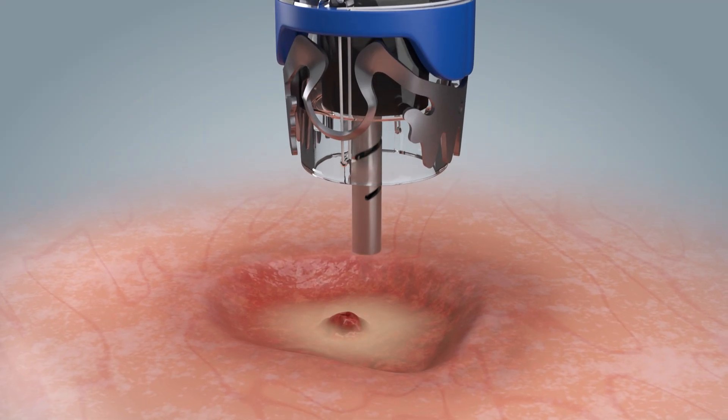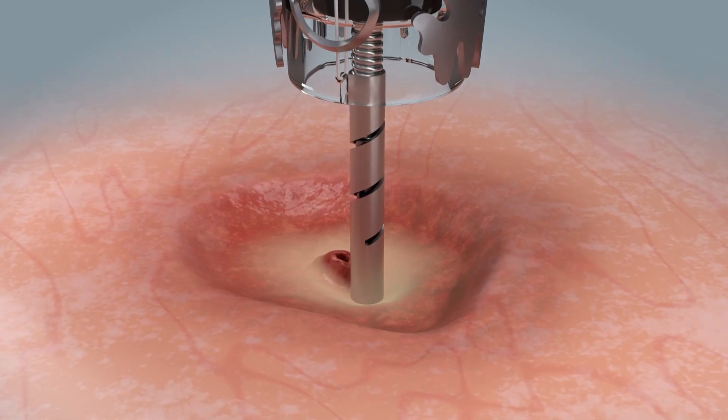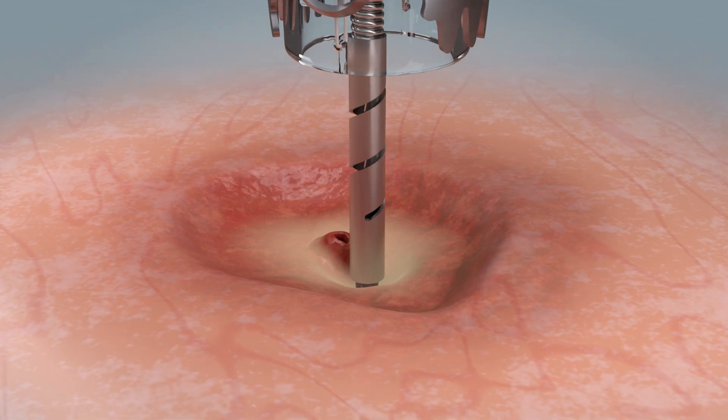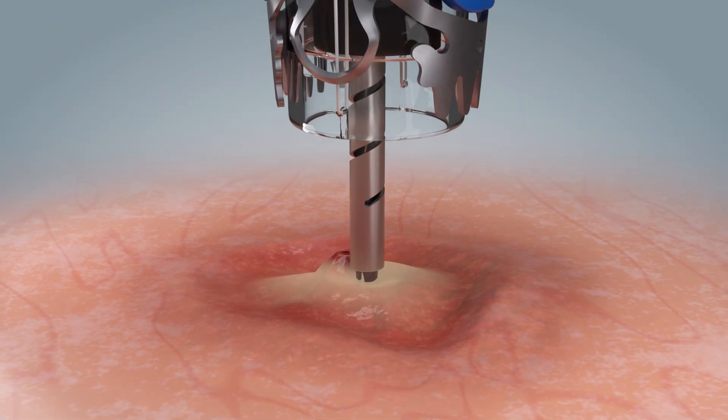Position the anchor so that, when the endoscope working channel is at 6 o'clock, it is also positioned at 6 o'clock, just below the lesion. This allows the lesion to be drawn into the cap space above.